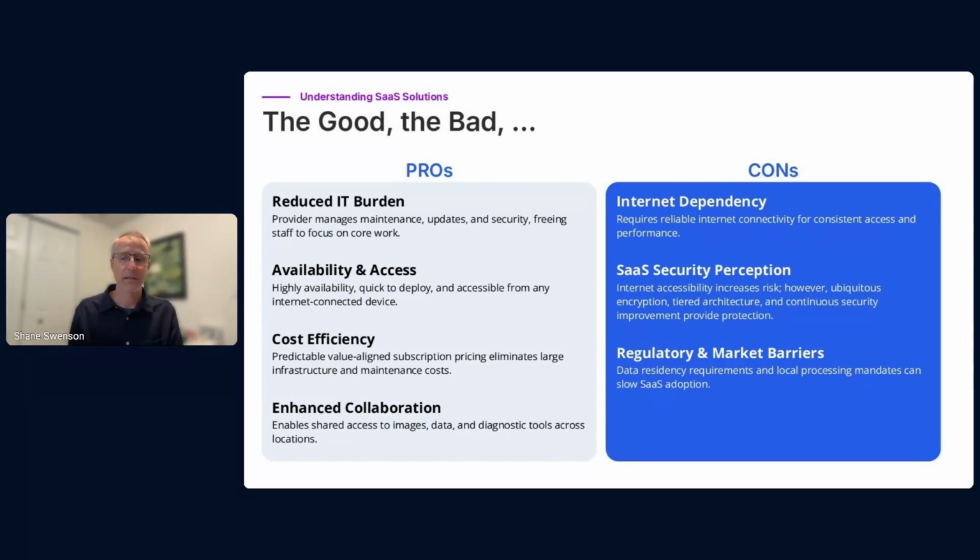Often there are valid pathways to use cloud systems, even in highly regulated environments, like healthcare environments, as long as the right security controls are in place. And the good news here is that the cloud vendors and the SaaS providers, of course, understand that and have the appropriate compliance controls available to enable those to be fully compliant.